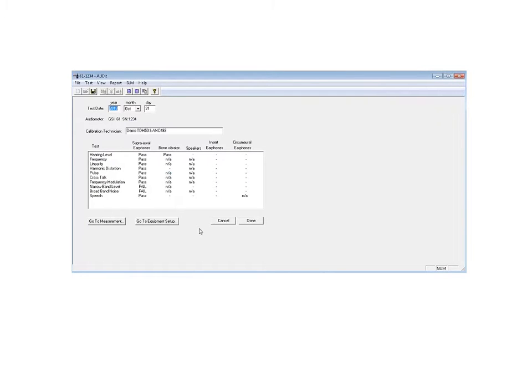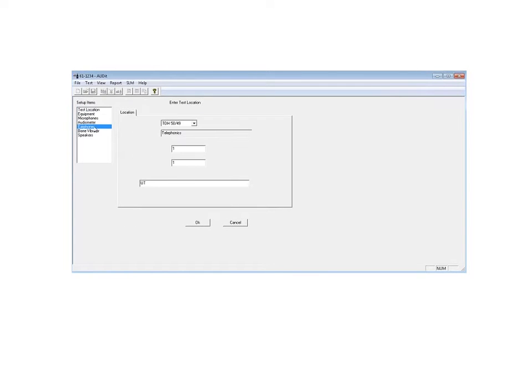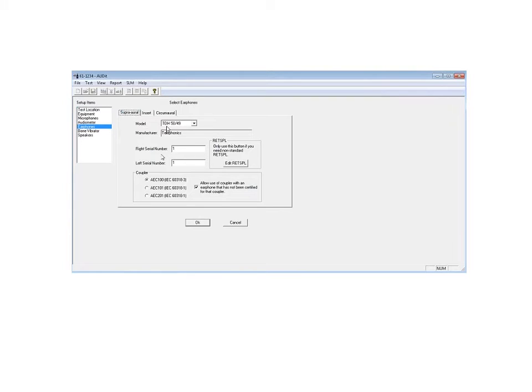The important thing here is to go to equipment setup and just verify which earphone we're using. In this case, we're using what's called a TDH-50 earphone. This one appears in the standard. They're very specialized earphones, and they have exacting characteristics that they're supposed to meet, depending on the coupler that's being used to test them and the model of the earphone.